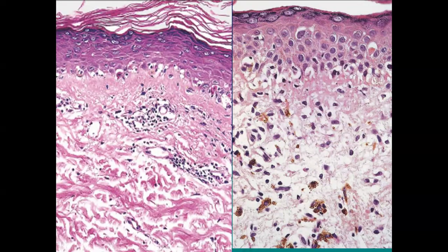just like EM, which we discussed a little while ago, and you could see there is no basal layer here because all the cells in the epidermis are spinous layer cells or polygonal cells. So there are no columnar cells. So the basal layer is completely gone. And in addition, there is basal cell vacuolation, and then there is pigmentary incontinence and some degree of epidermal necrosis as well.